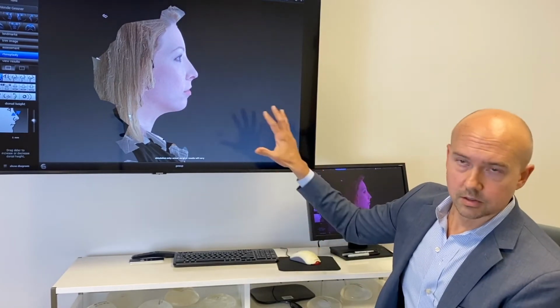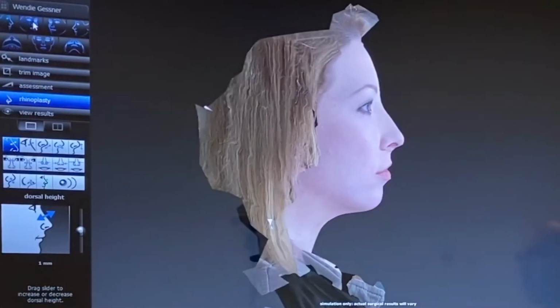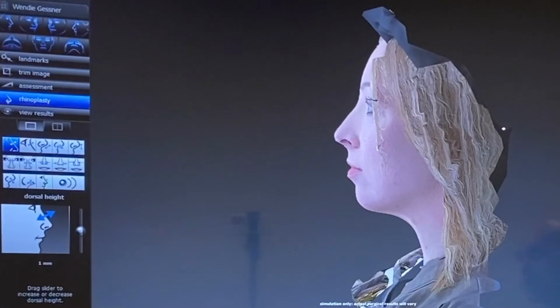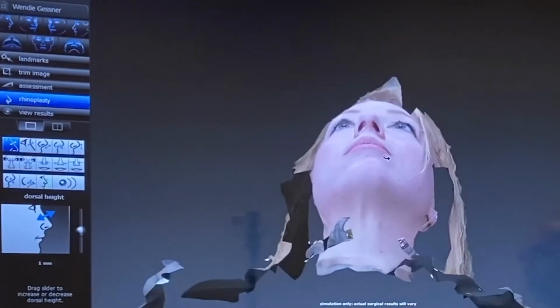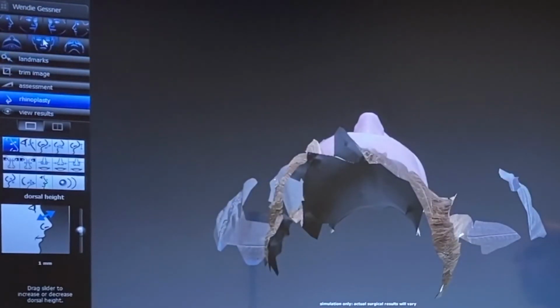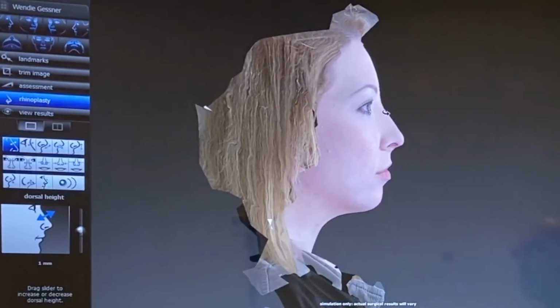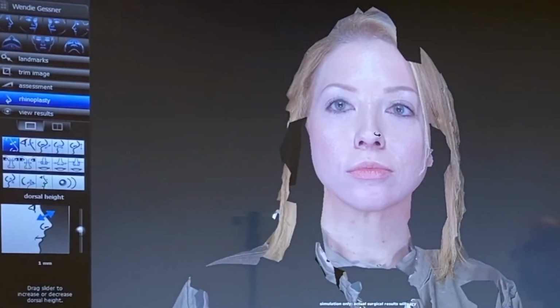So the patient comes in, gets the photos taken, and what's nice is that I can flip the head around and show you different angles of the nose, different views that you would not normally end up looking at yourself. I can do up top, from the front, and from the oblique. All those show different aspects of the nose that help when I change things. Her main issue was she didn't like the hump, and she didn't like how big the tip was. She stated that the nose was close to what her grandfather's nose was, and she wanted that morphed.